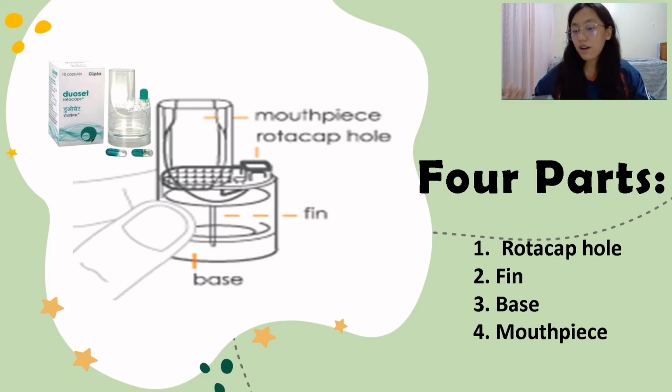Then we have the base. As I have said earlier, it is the one that is rotated to break the capsule. Lastly, we have the mouthpiece, which is the one inserted into the patient's mouth, where the patient takes a deep breath through their mouth to inhale the medicine, which is similar to the discus inhaler.